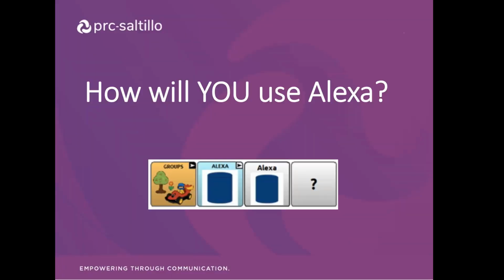So we learned a little bit. Do you have new ideas? How will you use Alexa? Are there new things you want to try? Does anyone not have an Alexa and they're like, ooh, I might have to get one? Or do you have some new ideas if you already have one? Some ideas that you might try. I hope it's helpful. We're going to open up with some questions too.